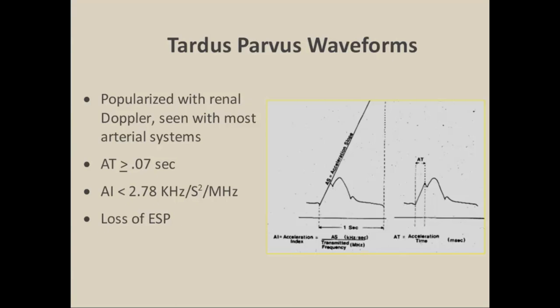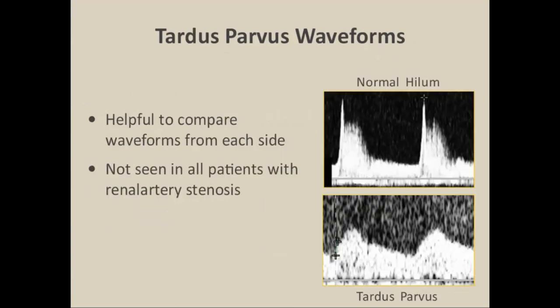Here are the numbers for characterizing the tardus-parvus waveform by acceleration time or index. Personally, I prefer to observe the waveforms and compare them from side to side. In this example, you can appreciate on the stenosis side the tardus waveform has a very abnormal contour with a delayed rise to peak systole, compared to the contralateral side which has a rapid systolic upstroke and early systolic compliance peak. Sometimes just comparing both sides makes the diagnosis relatively easy.